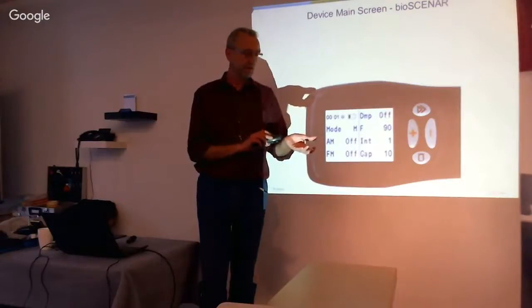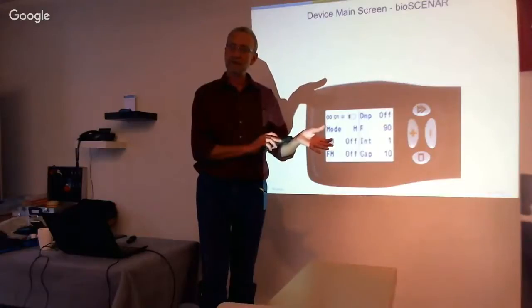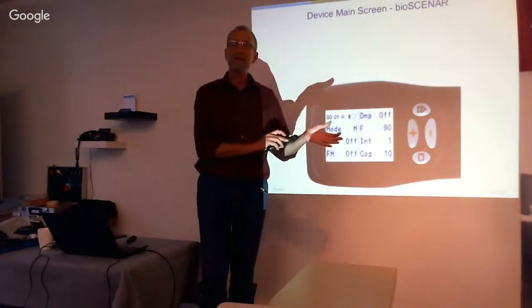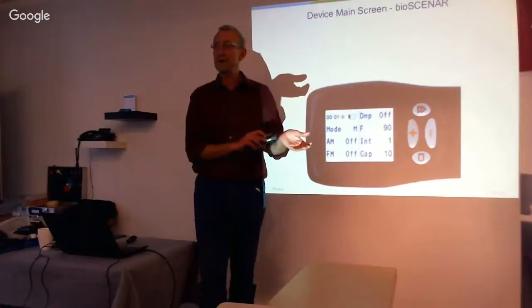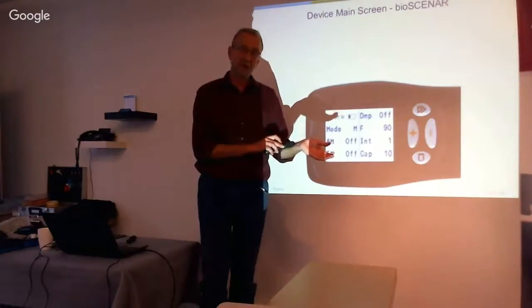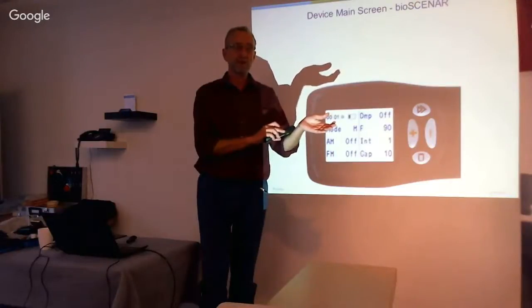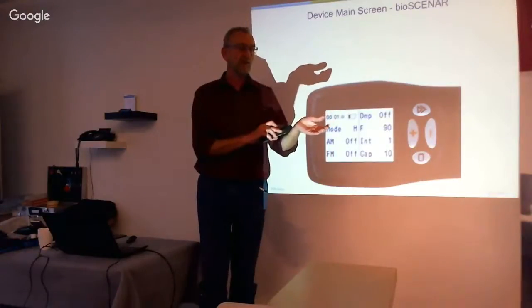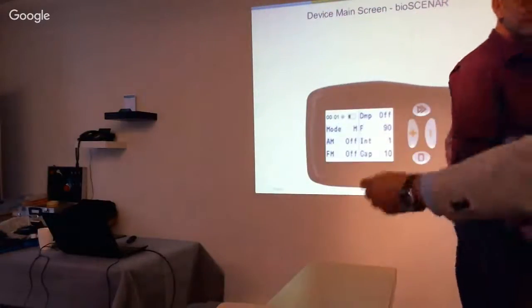So you put it on there and you turn it up, and you can hear the tickering going up till you feel something coming from the electrode, which is a nice tickling sensation. Of course, if you turn it higher, it will get painful, but we want to have it in a comfortable situation. So, have a try on yourself and see how it works for you.